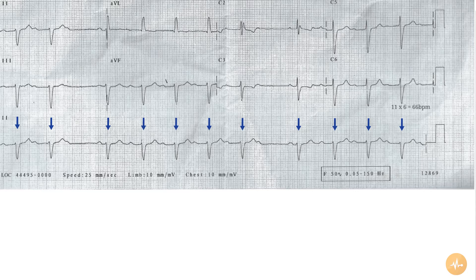This is second degree heart block of the Mobitz Type I, or Wenckebach phenomenon. The first conducted P wave has a PR interval of 200 milliseconds, or five small squares. With each conducted beat, the PR interval elongates.